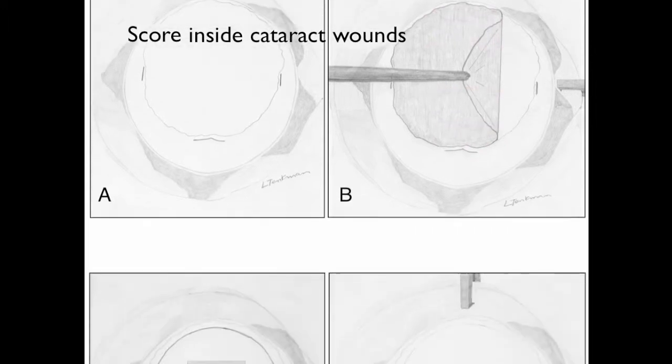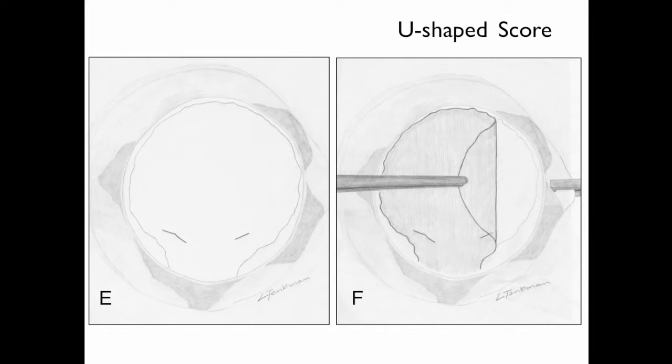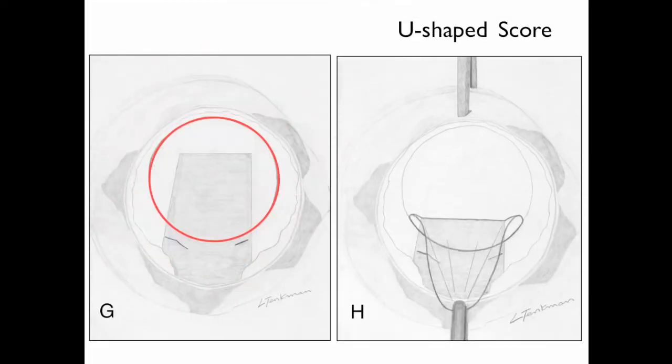The donor is taken to the cutting block and trephined, then peeled just like before, and it should separate before the endothelial cells at the lead edge are dragged on the opposing side. If the cataract wounds are close enough to one another, another possible strategy is the U-shaped score: simply score peripheral to the cataract wounds in a U shape. One has to be conscious during the peel to stop peeling before going through the cataract wounds. Peel number 4 cannot be done because the cataract wounds are in that location, so caution is needed on the final peel to avoid scraping the lead endothelial cells on the opposing scleral rim.